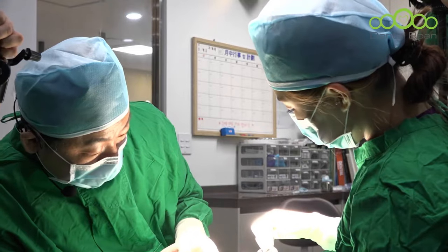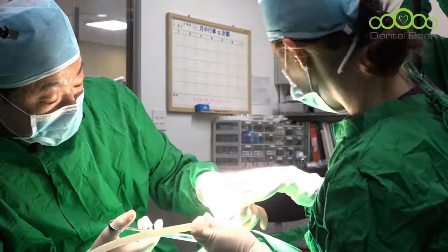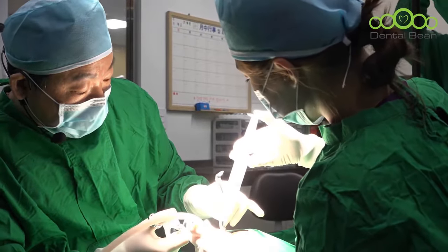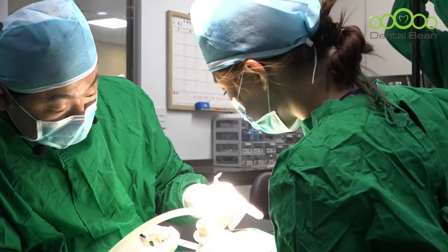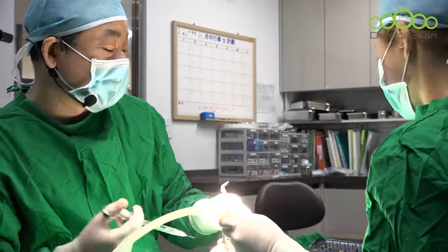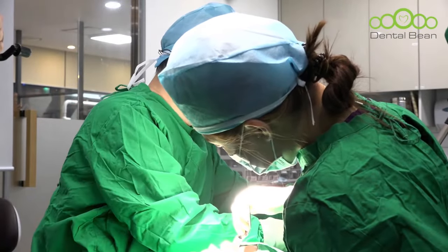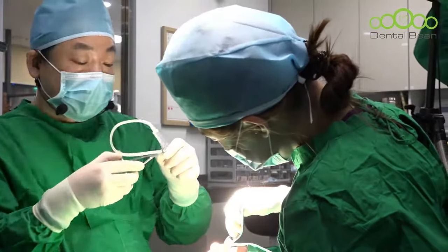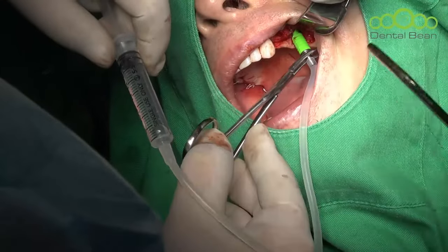Okay. Inject anesthesia slightly. Okay, done. I'll try again. Patient may feel some discomfort during the hydrolifting.